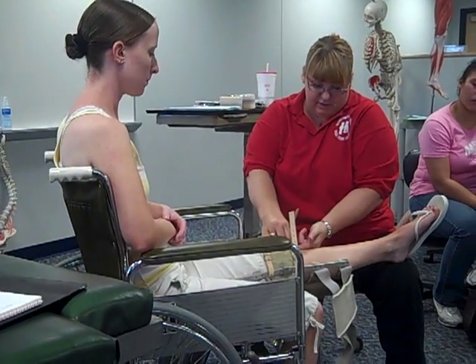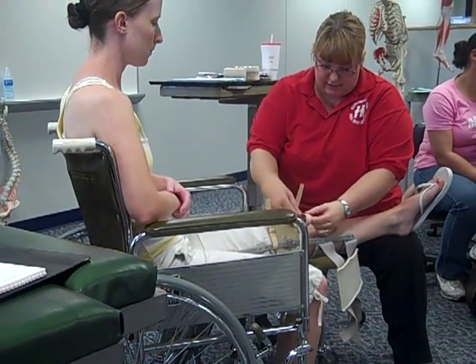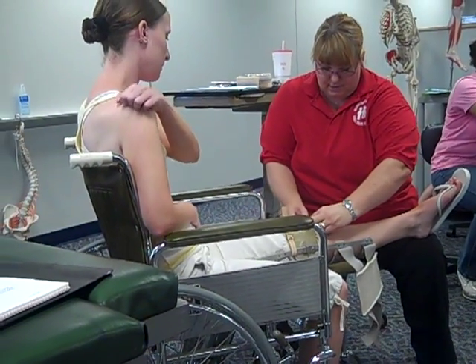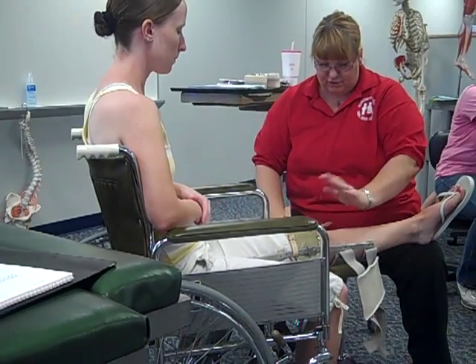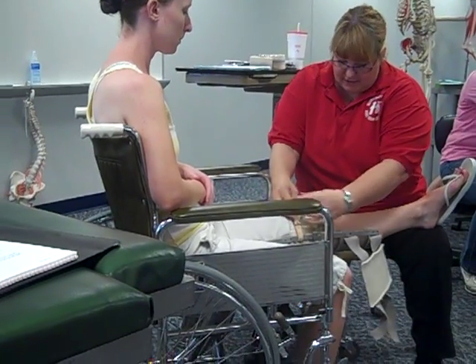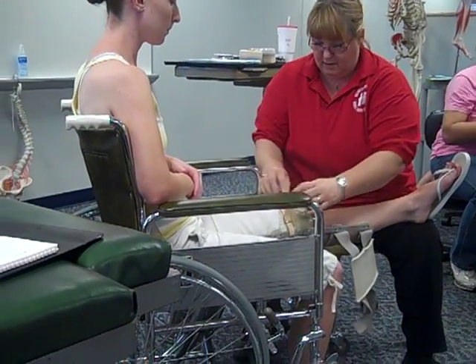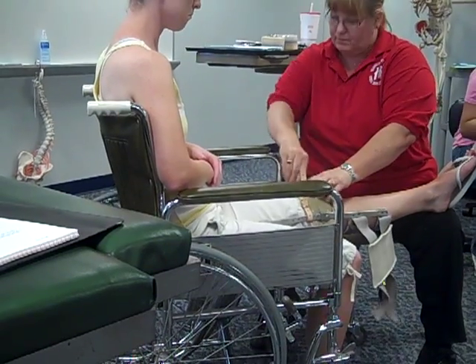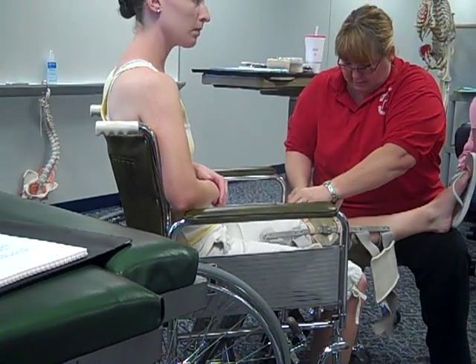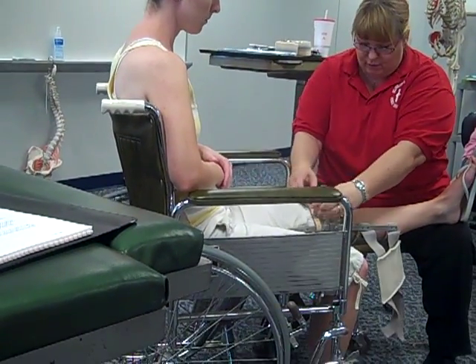I'm checking to see if I can get my finger in there — I can get my finger in fairly comfortably, so it's very tight. Once you get it through the hole, make sure you put the strap end through the loop — it keeps it from sticking out. This one up here I can put my finger in easily, so I need to tighten that one down. Is that feeling uncomfortable at all? I can still get my finger in pretty easily, so I'm going to even it up by pulling it to this side. You see how it takes some finagling back and forth — not the most exciting thing to watch.